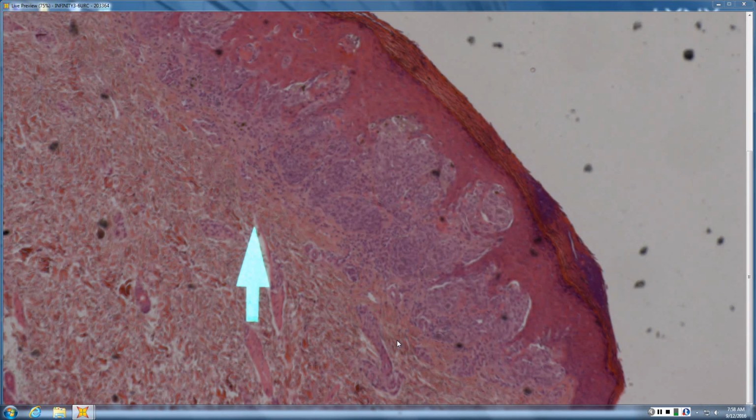Benign Spitz nevi tend to be a mix of spindle and epithelioid cells. Young women on the legs and males on the back have purely spindle cell lesions. But purely epithelioid compound lesions tend to be melanoma. So Spitz nevi are spindle and epithelioid cell, S&E nevus. A pure spindle cell variant exists, on legs of women and trunk of young men. A purely epithelioid compound Spitz-like tumor is probably melanoma. So you've got your V, you've got your dispersion, all of those things can help.